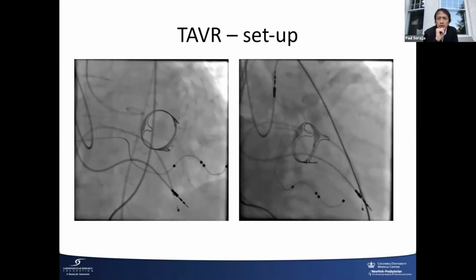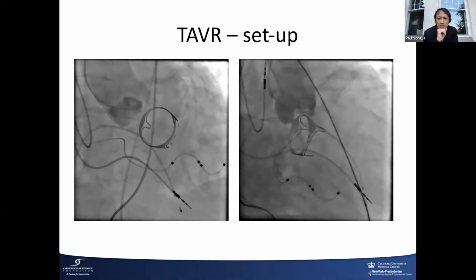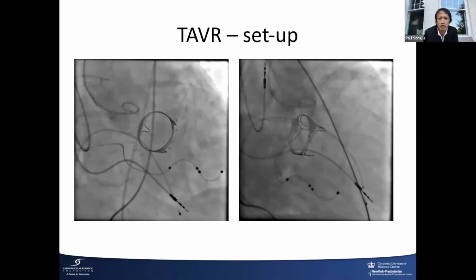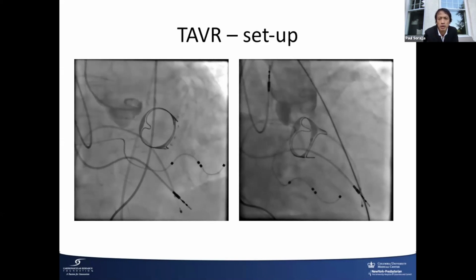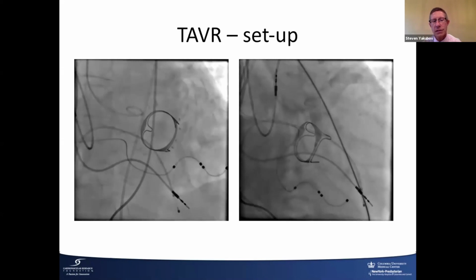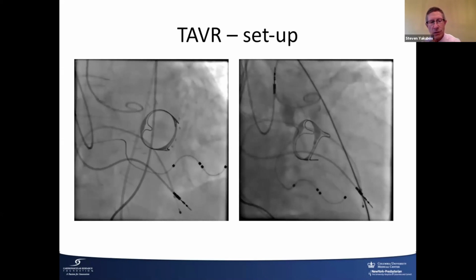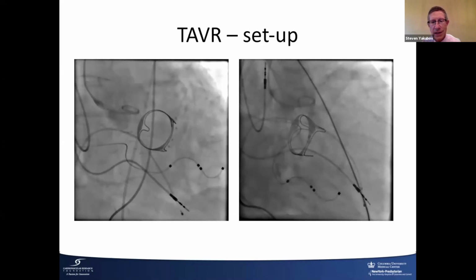We already heard Sushil's going to do true sizing essentially to keep it from 5. Would you oversize it if there wasn't a strut there to push you out of the way? I'd oversize it as long as my sinuses were okay. I don't think these sinuses are quite large enough to go the next size up.